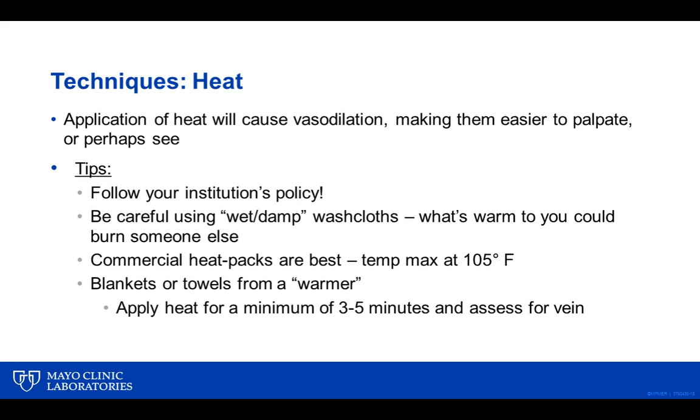So you want to make sure you can wrap the whole arm, you can wrap the whole patient up in warm blankets if it's okay with nursing. If there's a reason, like they're running a fever and you don't want to apply too much heat, just stick with the arm where you're going to draw. But give it a good 3 to 5 minutes of warming before you take a look again. Just place your tourniquet again in the area that you have heated, and just repalpate and see if any veins pop up. A lot of times the hand works really well. You can warm a hand up and a vein will pop up for you.